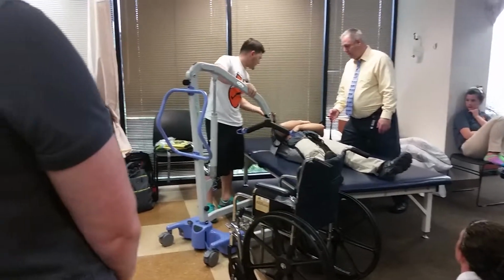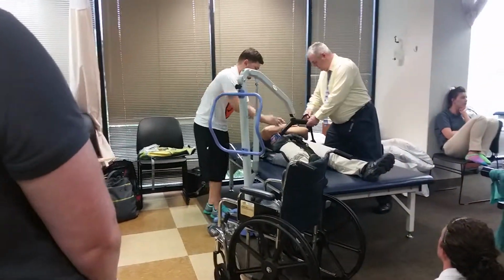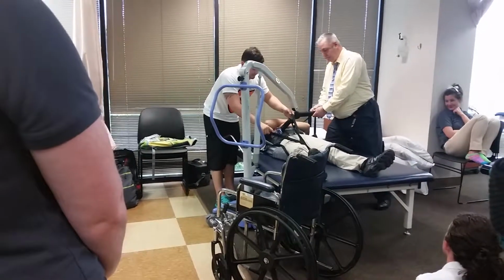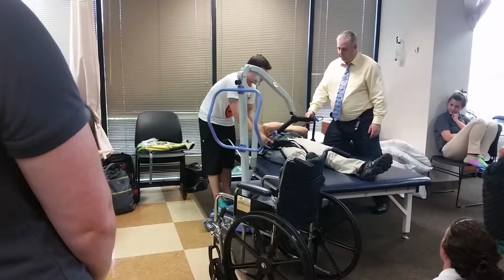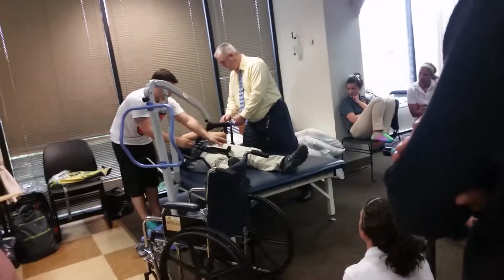Yeah, when I did it myself, it's always, the way I do it is the longest one on the bottom. So the bottom you use the longest one, and on the top you use the shortest one. But we only have one. Yeah, we only have one choice.